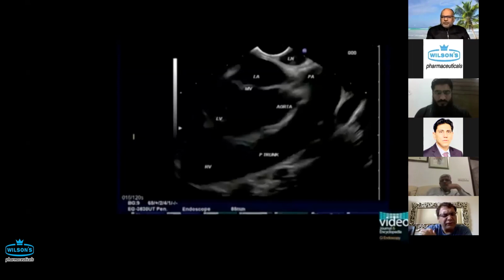So on that perspective, Saad Bhai and Amjad Bhai, have you encountered complications with this mediastinal EUS? I personally haven't. Maybe I'm not doing much, because since endobronchial ultrasound, our cases have dwindled. We used to get many more.